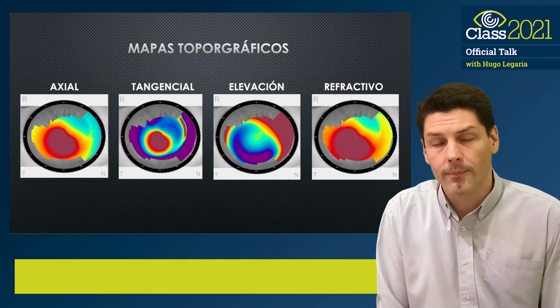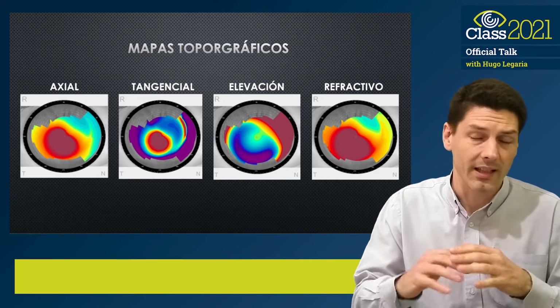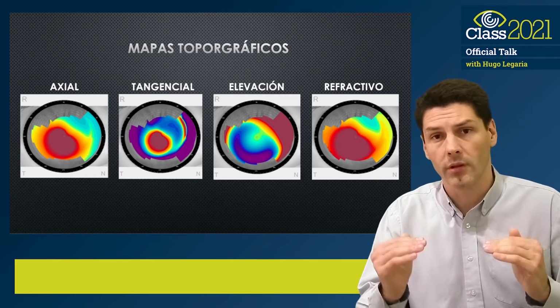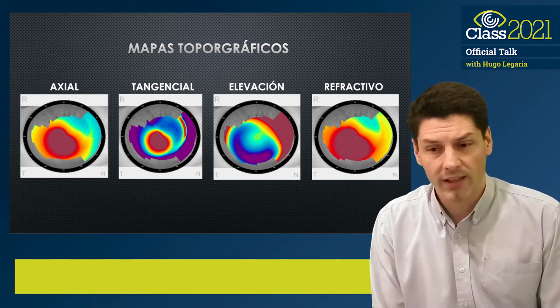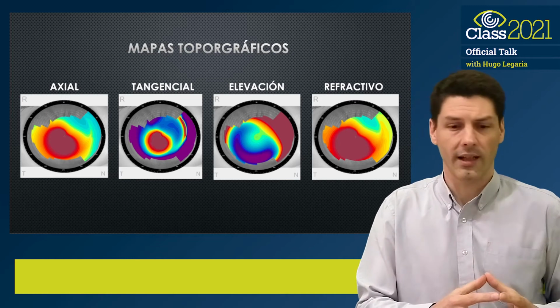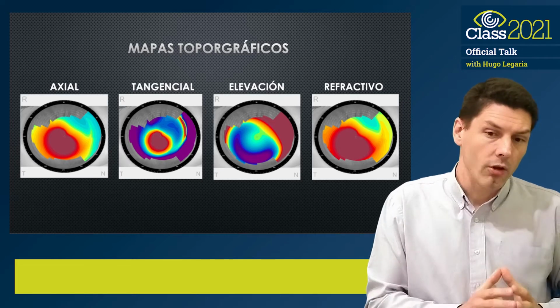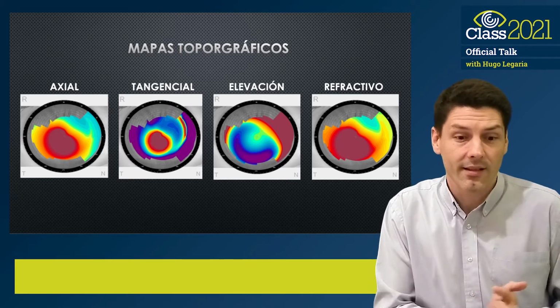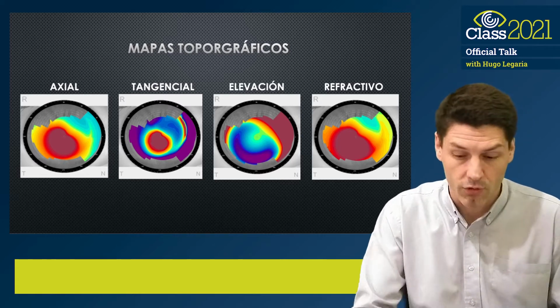The elevation, that refers to a sphere and tries to mathematically represent the cornea in the best possible way, and on that sphere we obtain information about how many microns we are up or down with respect to the corneal tissue, and the refractive map that gives an optical entity to the cornea and therefore gives us a representation of refractive power in each area, concentrating on fitting, geometry and wear. And the maps that provide the most information are the axial, the tangential and the elevation.